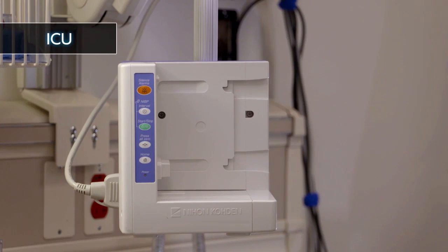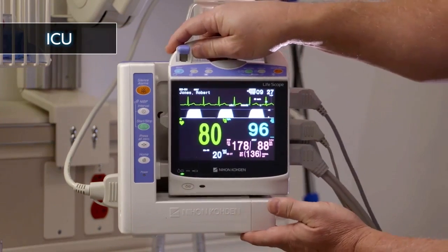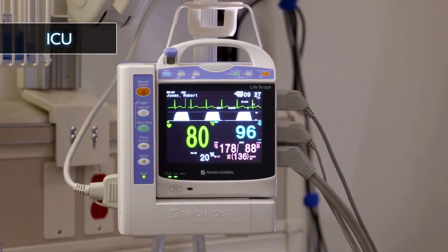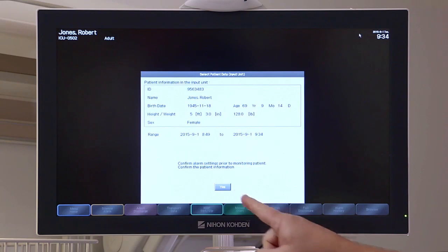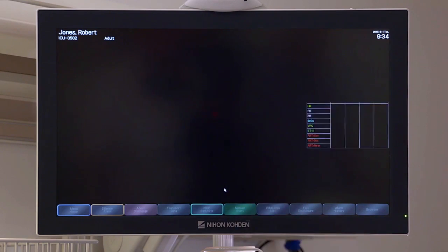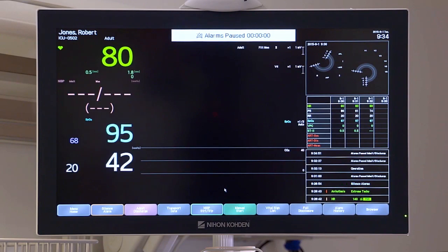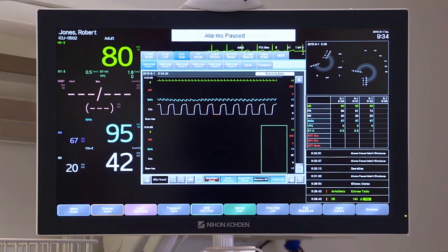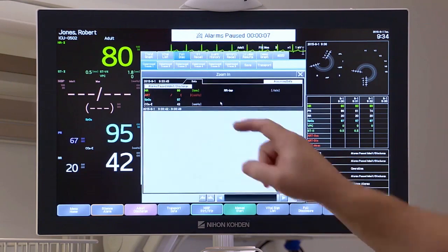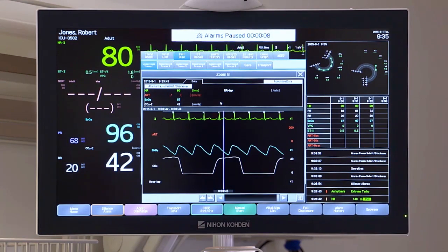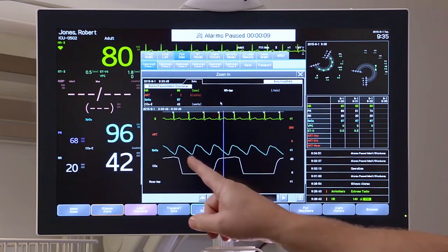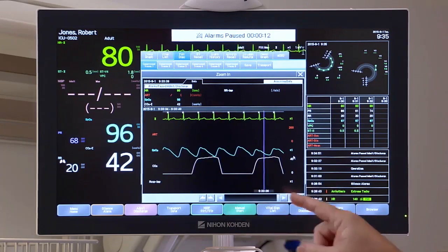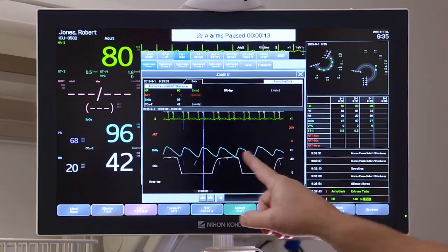When the patient reaches the ICU, slide the LifeScope PT into the LifeScope G9 bedside monitor in the ICU. LifeScope PT becomes an input unit again. The LifeScope G9 bedside monitor shows the saved waveforms and data from transport.